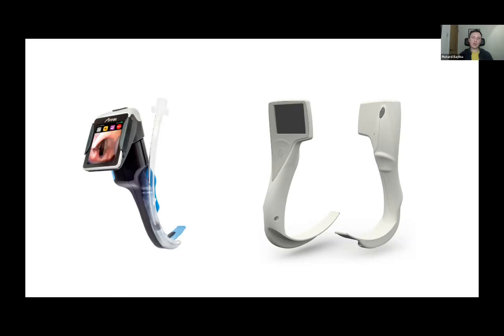It's a channel device, so the tube fits down the side, as you can see, which means that you don't need a bougie or a stylet to assist it. That guides it directly towards the visual field of the device. And they have a range of patient sizes.